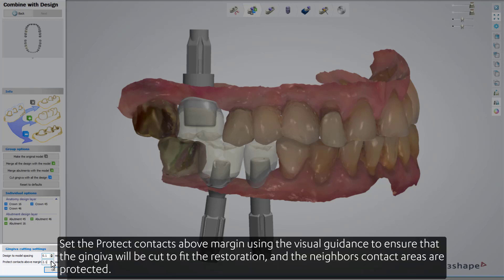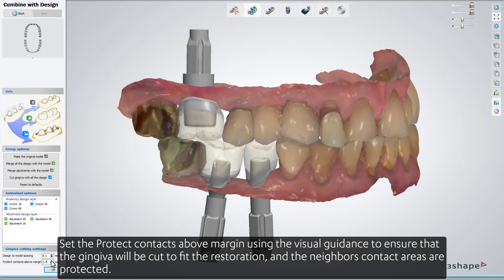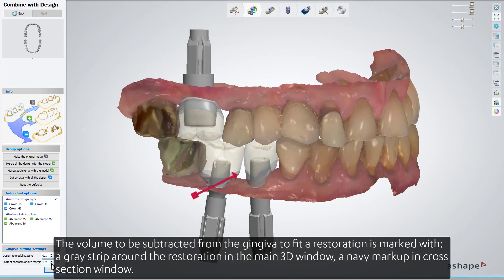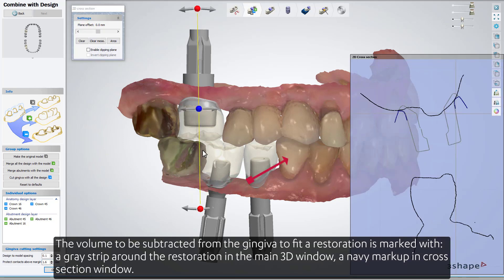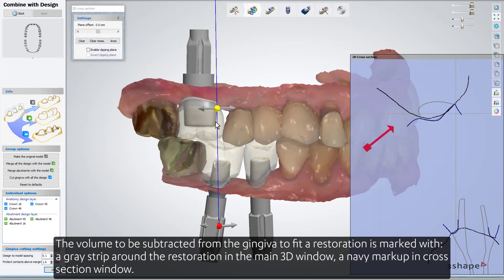Set the 'Protect Contacts Above Margin' using the visual guidance to ensure that the gingiva will be cut to fit the restoration and the neighbors' contact areas are protected. The volume to be subtracted from the gingiva is marked with a grey strip around the restoration in the main 3D window, and a navy blue markup in the cross-section window.